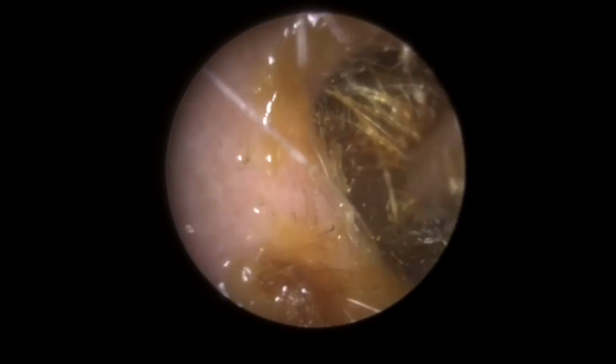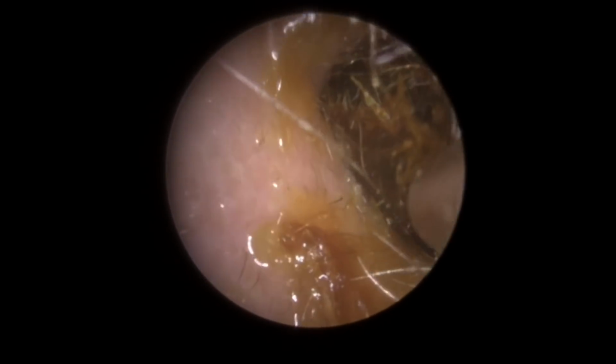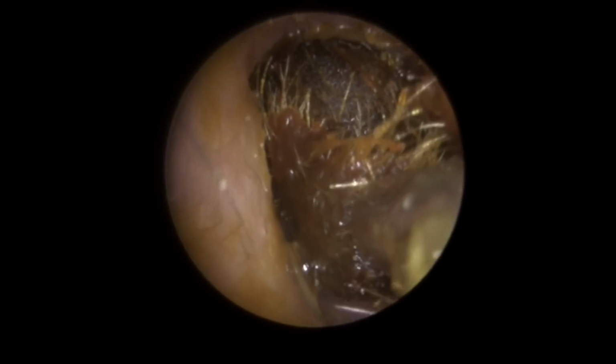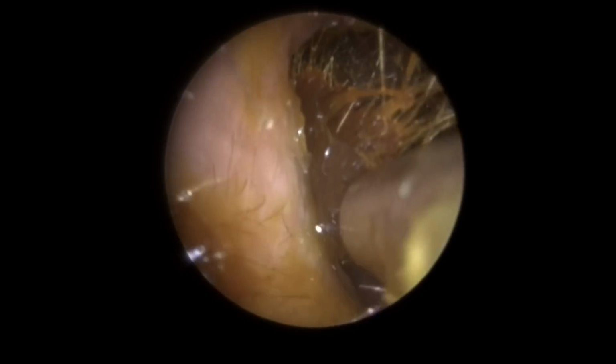It's really starting to move. Now it's starting to come away. Don't forget, we will have to bend this as well. You can see as it comes forward, it needs to bend across to the left hand side. I'm trying to hold on to it and get a really good wiggle. A little bit more olive oil in there now just to help ease it along its way. There we are. I'm trying to get a really good grip on this center section.